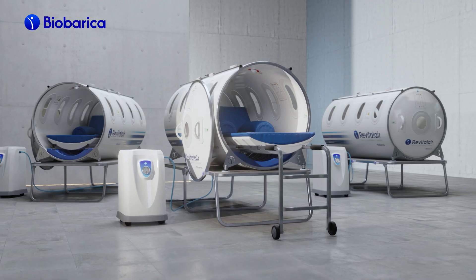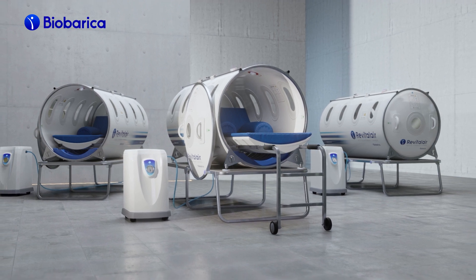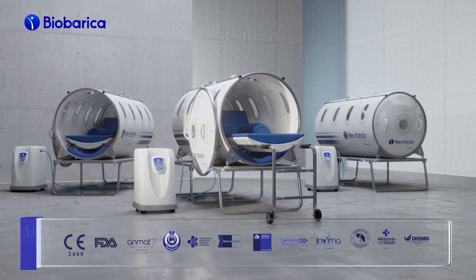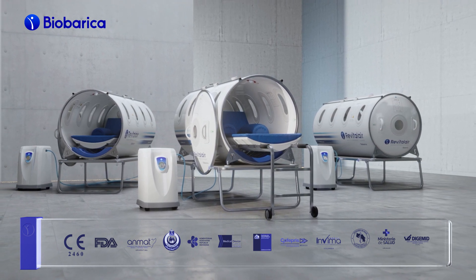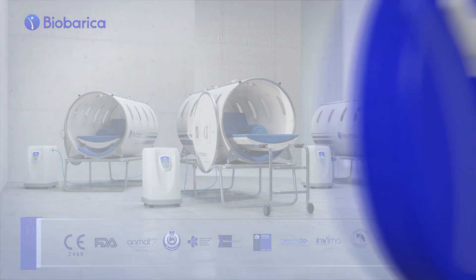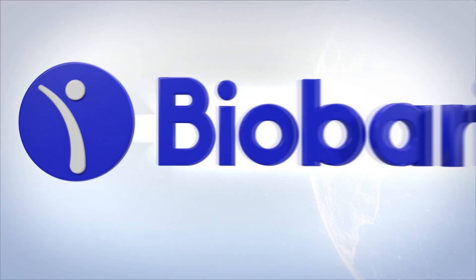It is a product with innovative technology and high therapeutic efficiency, certified as a medical device by different international organizations such as CE and FDA in more than 35 countries. Biobarica — Proven Therapeutic Efficiency.